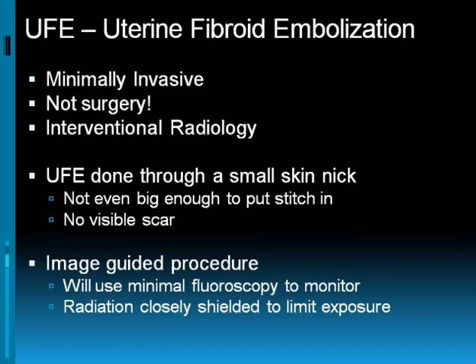This is a procedure done by interventional radiologists, who are physicians like myself who have training in using imaging techniques to guide our procedures without actually making large incisions. UFE is typically done through a small skin nick down in the groin. It's not even big enough to put a stitch in and typically does not leave a visible scar.